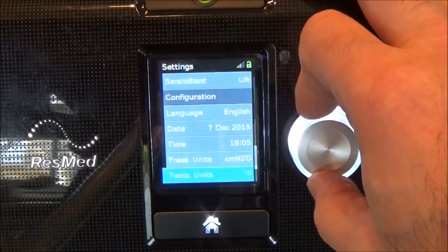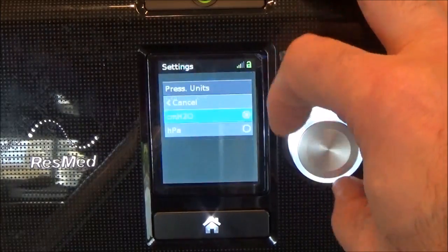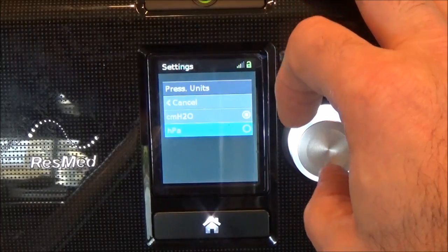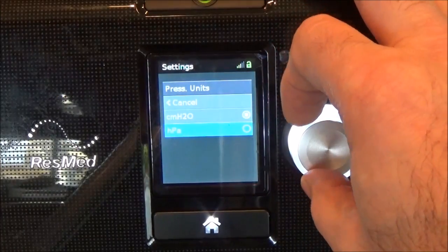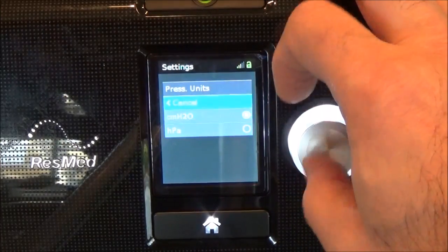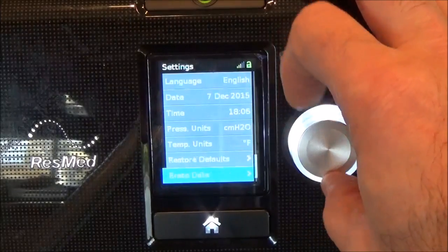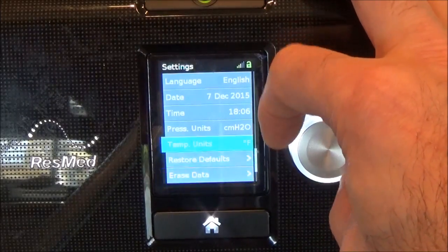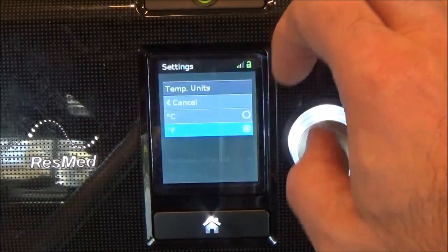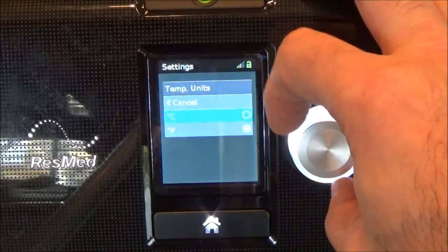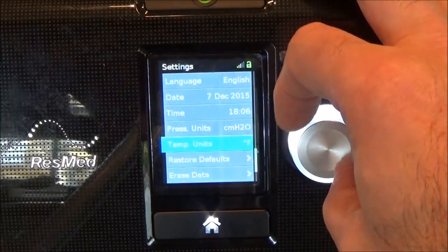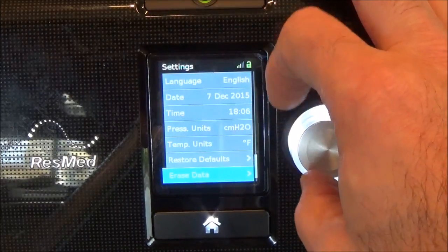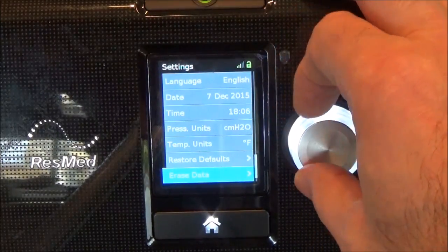You can select the date and the time. You can have pressure displayed in centimeters of water pressure, or as everyone's favorite, hPa. You can select Fahrenheit or Celsius. This is also where you can erase the data from the data card.